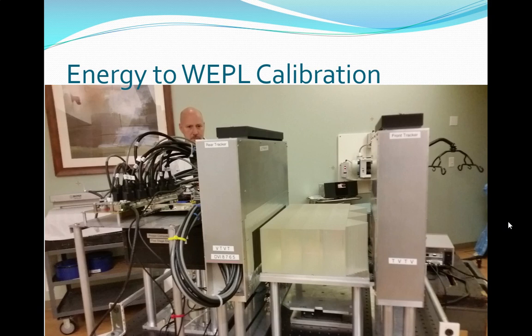So when we do our initial area, we want to find out how well the proton beam and spec out their proton beam, how it spreads, all kinds of other stuff. So we start with just one block. We keep adding blocks as we go through. And then we next go with just the diamonds and then add blocks to the diamond, so those pyramid wedges. And this gives us between one block width that's in. So we want at least one with just the straights, and we want some of the wedges. And so there's a whole procedure you have to go through. But essentially, we're able to measure them.